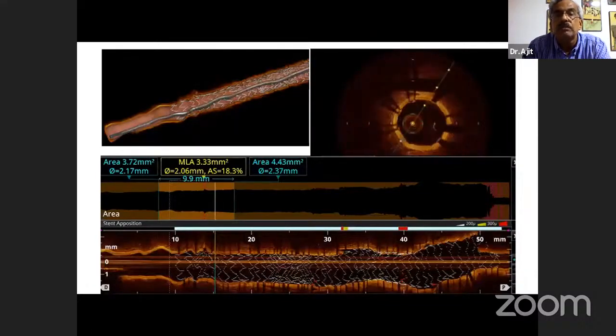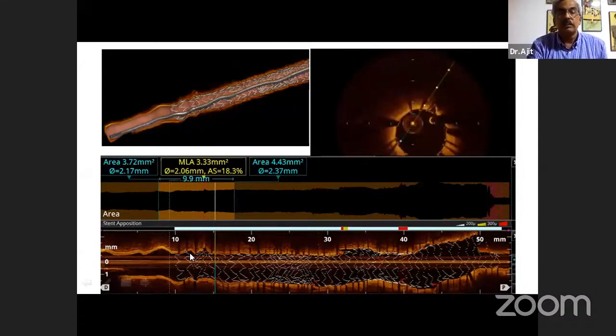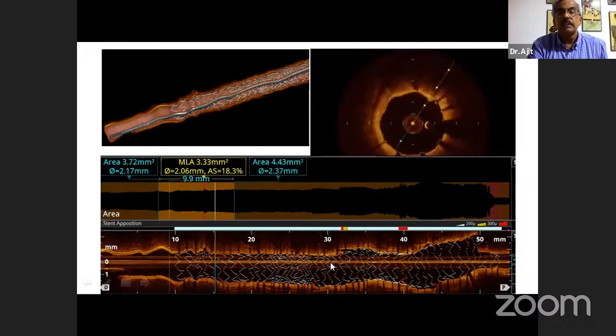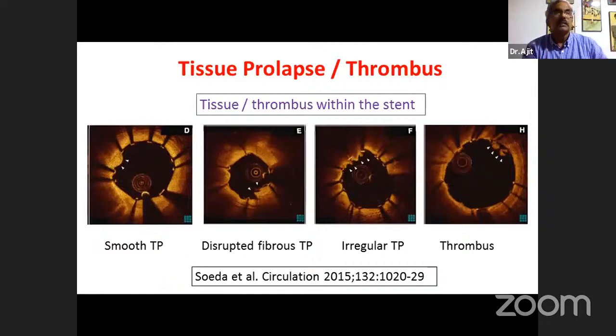and you can be very, very sure about how they have put the stents in place. Another patient with, again, intramural hematoma, which we have fixed. And here you can see the stents, they sort of crimp together and come together in these patients. And again, we should be very careful when you're putting these stents that you don't crumple them, especially in the proximal part, you can get them crimped.